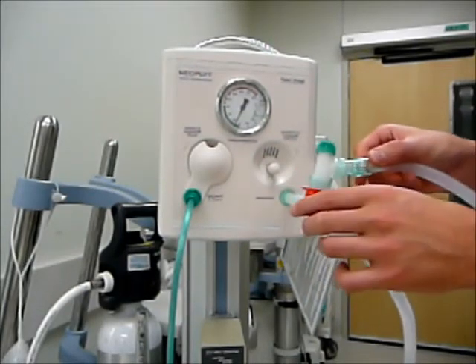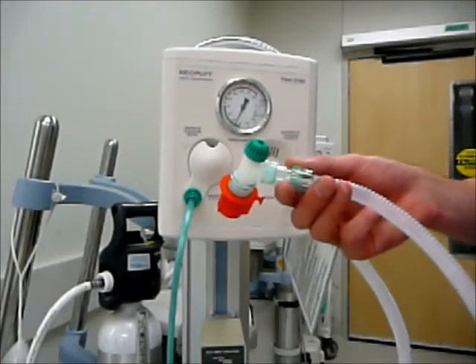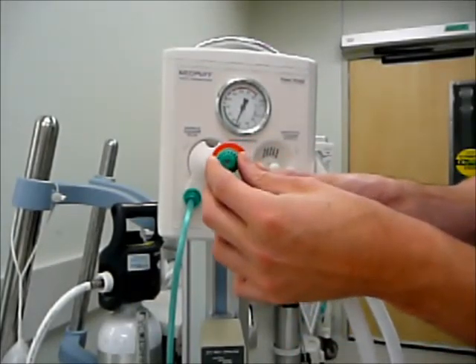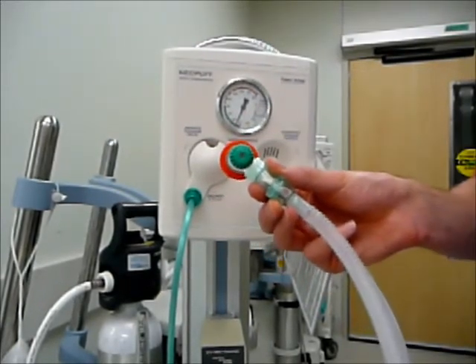After that we are next going to want to look at setting our PEEP. In order to set our PEEP we still continue to have the end of the circuit capped. We are going to adjust our PEEP dial up and down, and we want to set it so our PEEP is reading 5 centimeters of water on our pressure manometer.